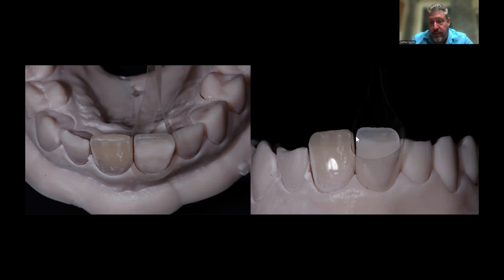Then I'm going to bulk fill this tooth. Once I get the mesial and distal right, and I have the incisal edge right, I'm going to wrap a mylar strip around the tooth and shove it under the gums. I can even move the gum line with this. This is what Marshall Hansen teaches.